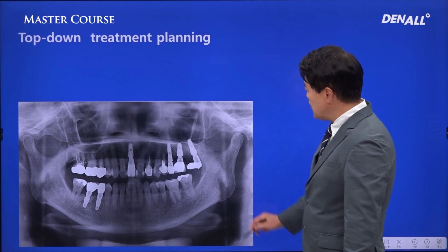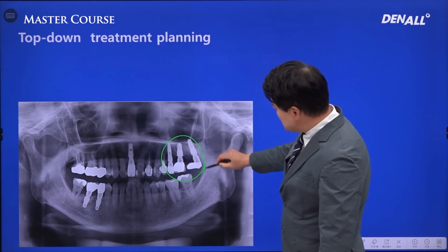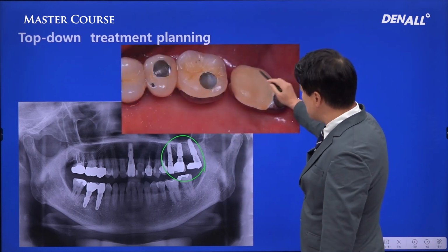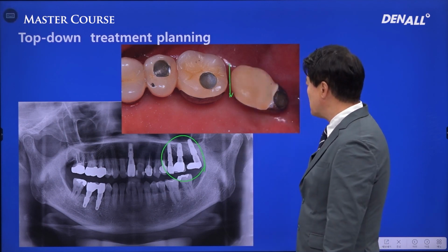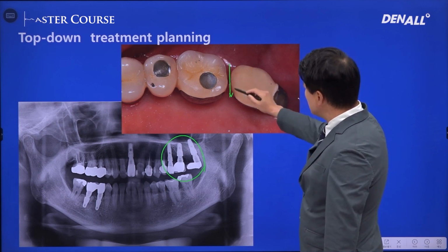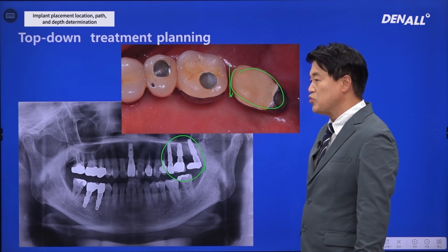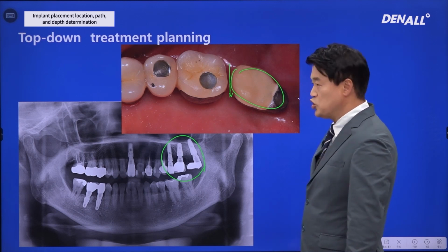If you look at another case here, when implants were placed, the directions are not proper. So this is the resultant prosthesis. Here, food retention can occur, and the patient will complain. And the cantilever force is applied in this design, which is hampering the stable maintenance of prosthesis.